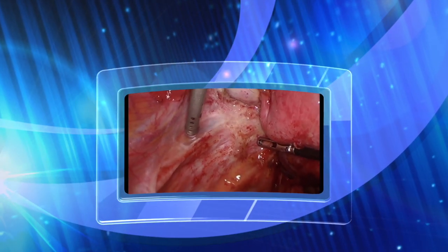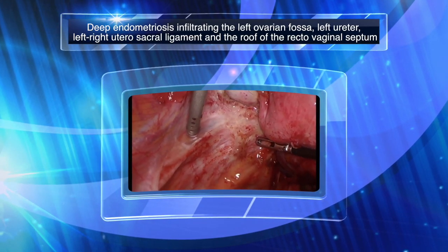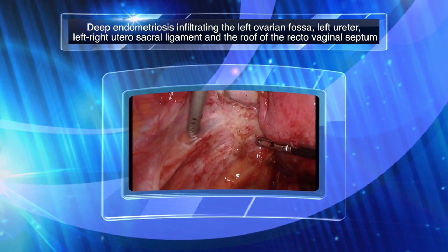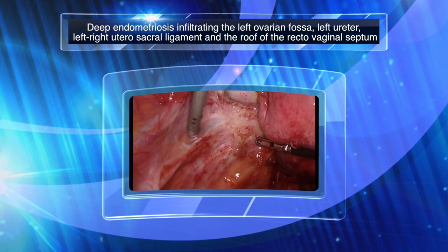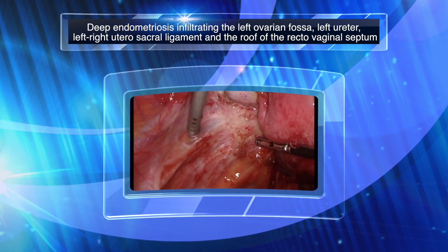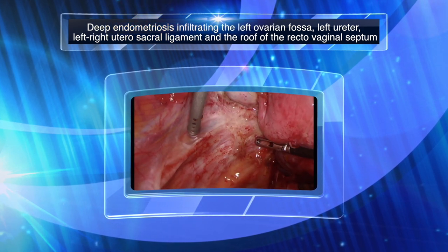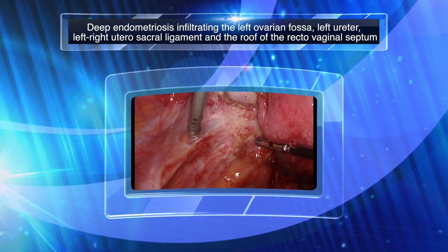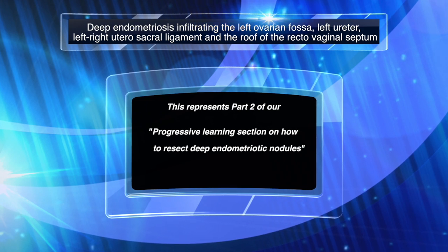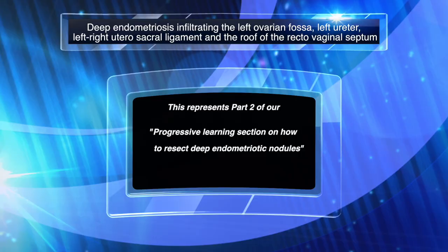Deep endometriosis infiltrating the left ovarian fossa, left ureter, left and right utero-sacral ligament, and the roof of the rectovaginal septum. This represents part 2 of our progressive learning section on how to resect deep endometriotic nodules.